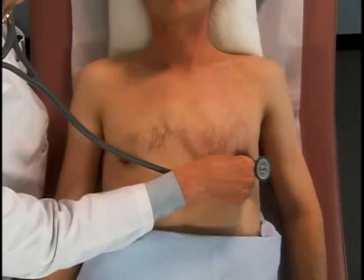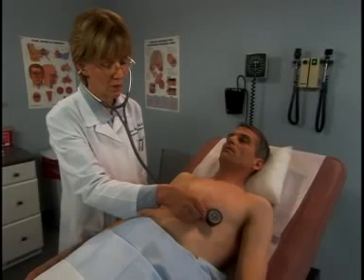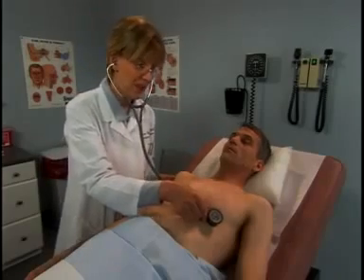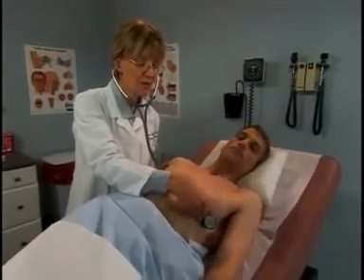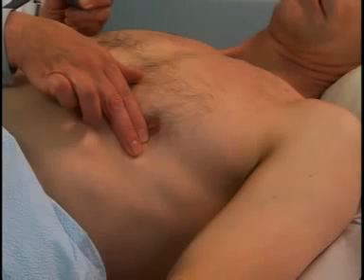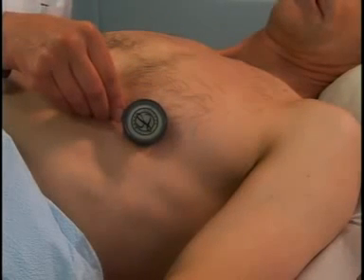To improve your ability to hear S3, S4, and the murmur of mitral stenosis, place the patient in the left lateral decubitus position. Have the patient roll part way onto his left side. Now tip onto your left side. This brings the left ventricle closer to the chest wall and makes low-pitched sounds more audible. Then recheck the position of the apical impulse and place the bell lightly over that location.